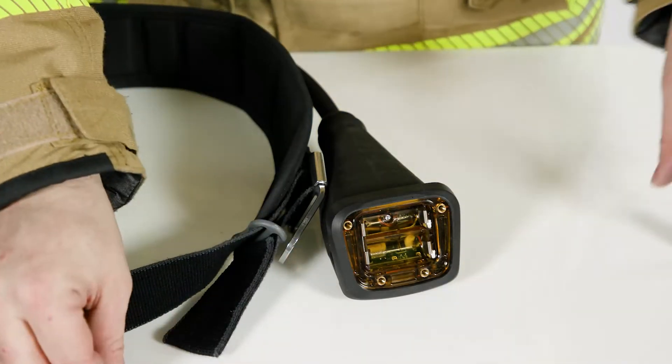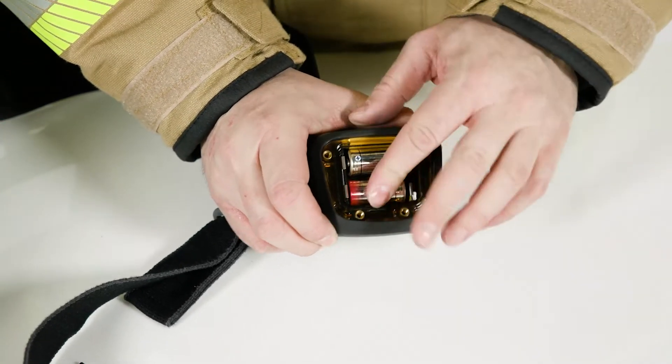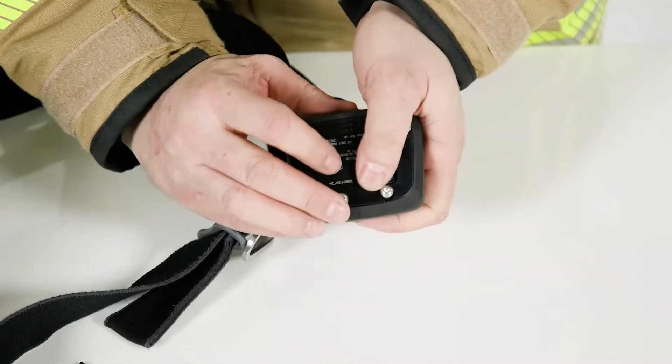Only use batteries approved by Dräger. Reposition the lid. Retighten the screws. Do not over-torque.